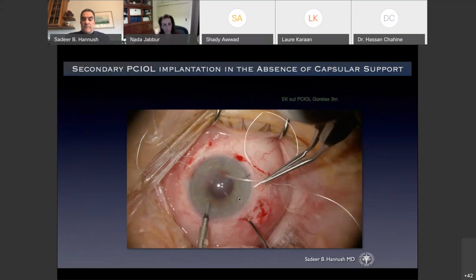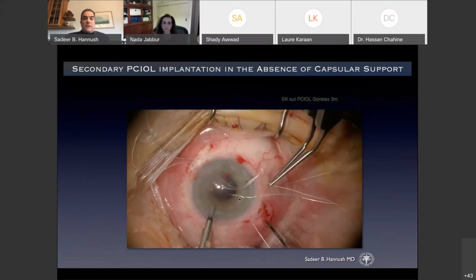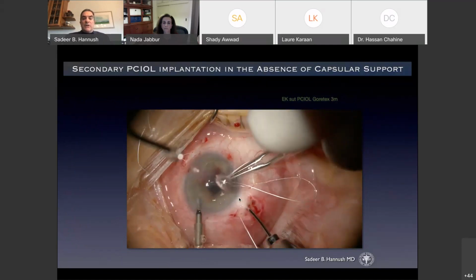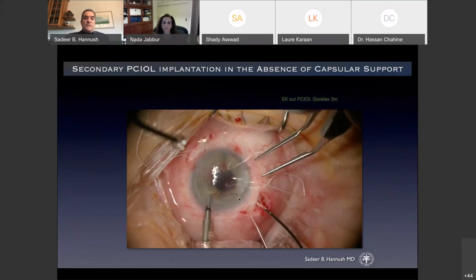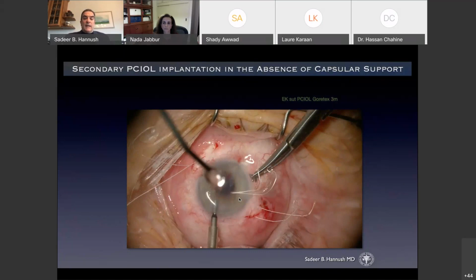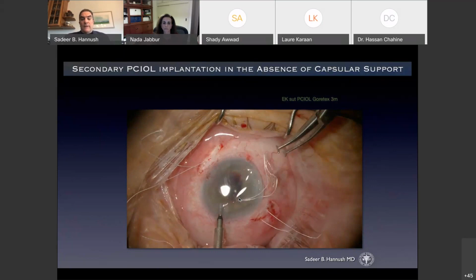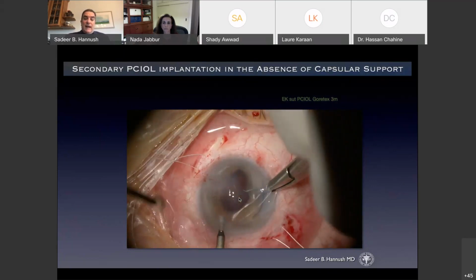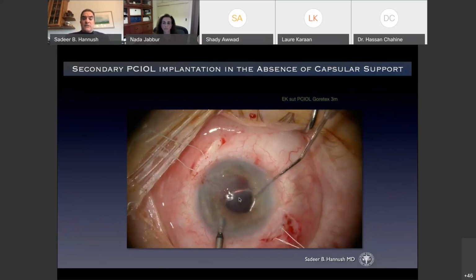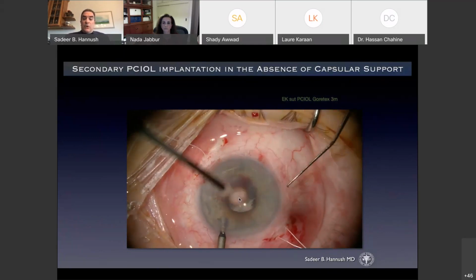So all of you recognize Gore-Tex, and you can do a lot with Gore-Tex. One thing that took the retina field by storm is the use of Gore-Tex to suture Bausch & Lomb's Akreos lens, which is the AO60 lens, and it was published in the retina literature and became very popular. As you know, the Akreos lens is a hydrophilic acrylic lens, and in many of these cases that are complicated and that require gas, many of these lenses will opacify.